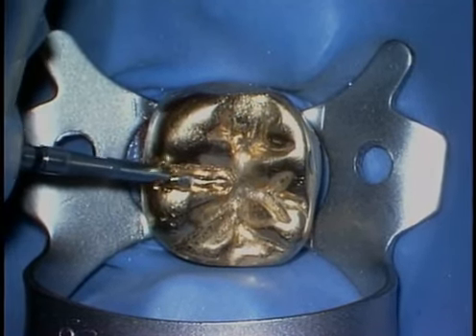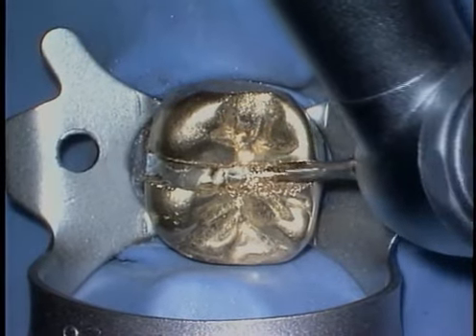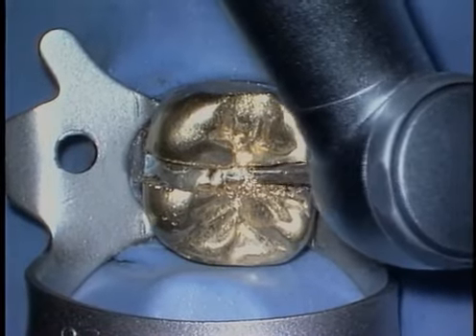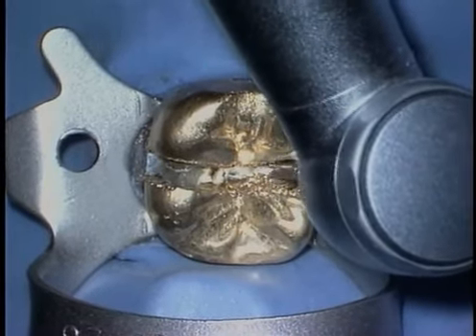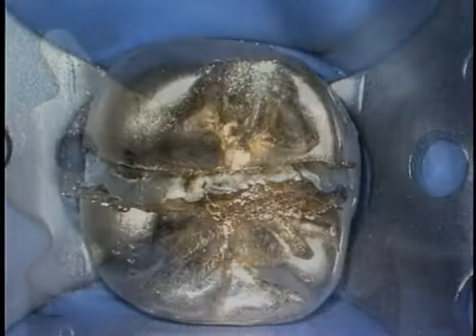What we want to do is carry a slot across the top of the tooth. Once the slot has been created, then we can think about placing a crown splitter into this groove. Be careful to stabilize the burr and have a good fulcrum because you don't want to skate off the tooth and inadvertently injure the patient.